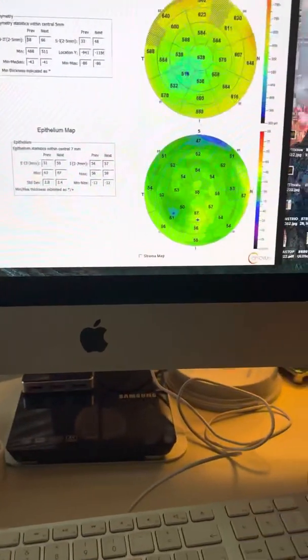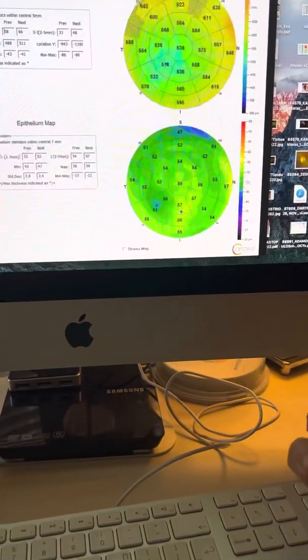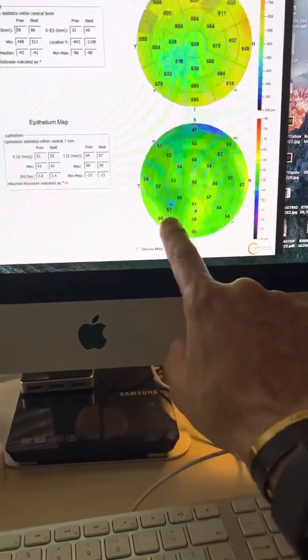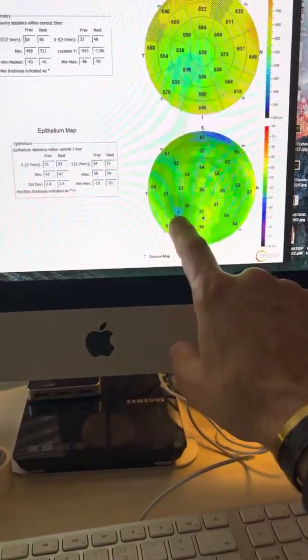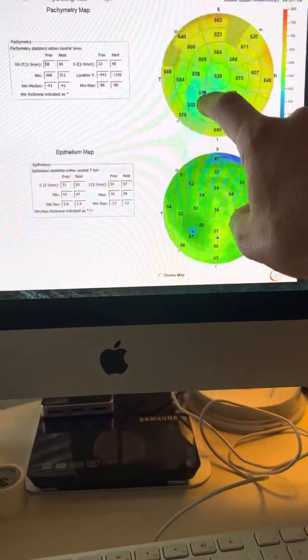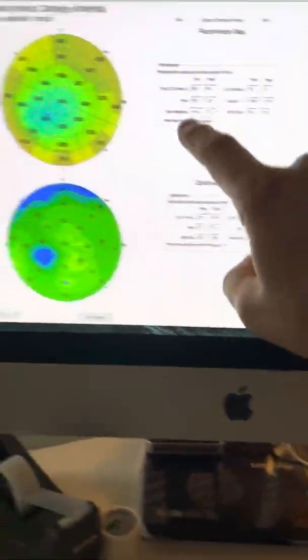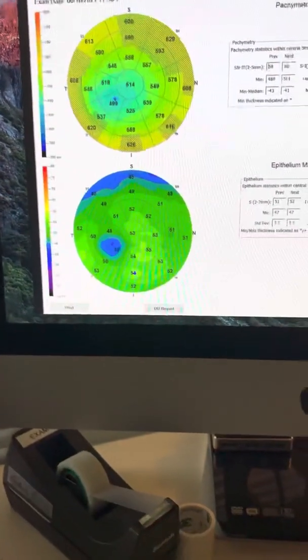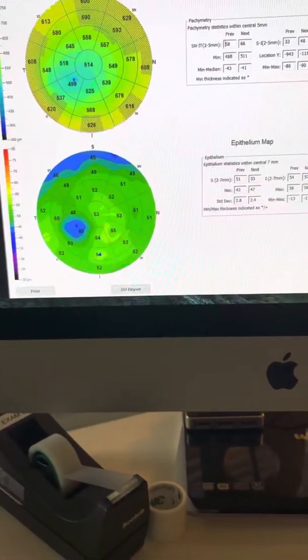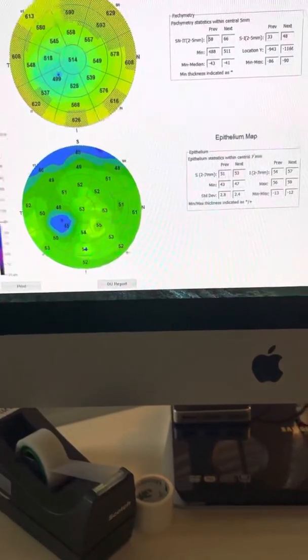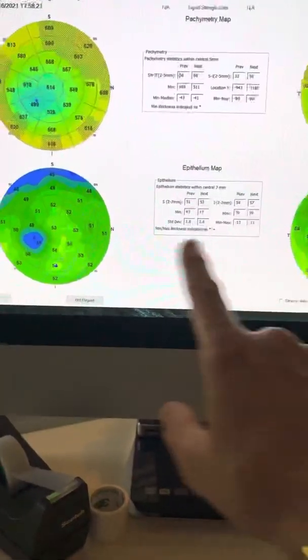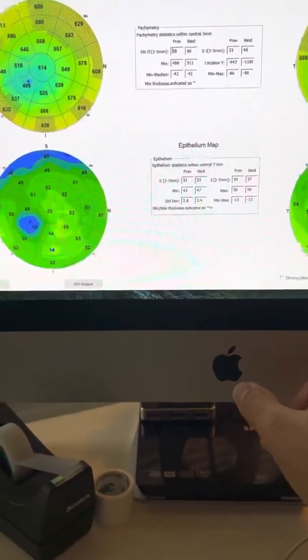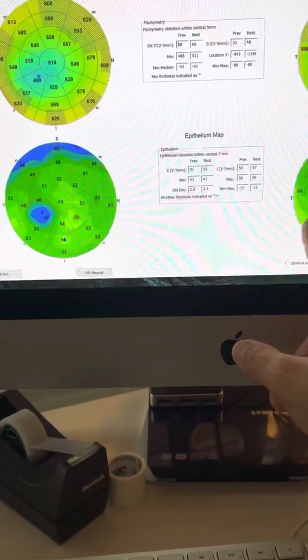Now this on Pentacam maps may appear a little bit steeper, but in essence, the cornea is thicker. The cone area is 516, it was 499. So the cornea has thickened almost, not almost, exactly 17 microns. The epithelium has thickened. So part of the thickening of the total cornea is epithelial, but not all of it. It's stroma as well.